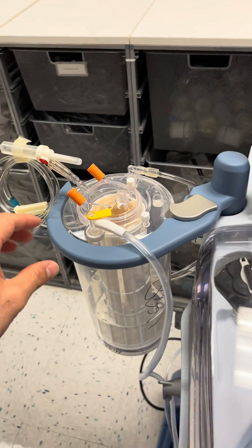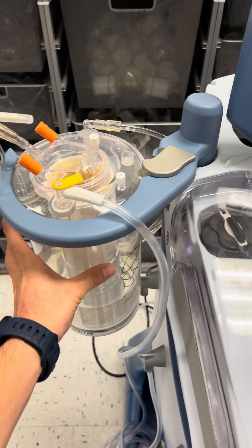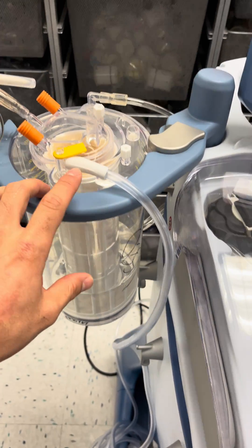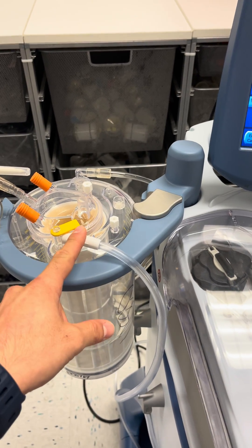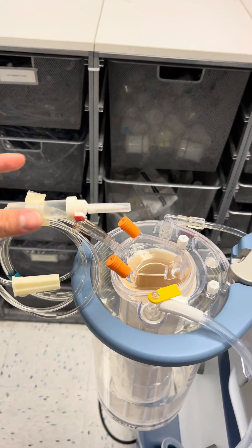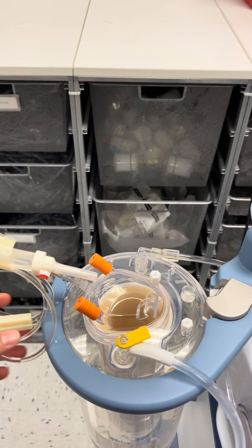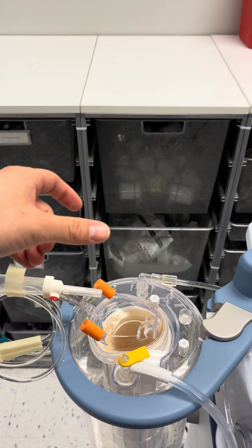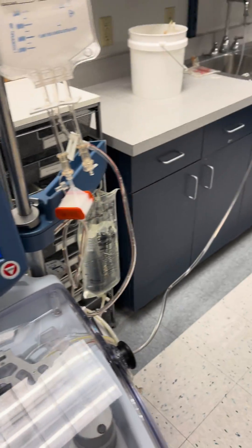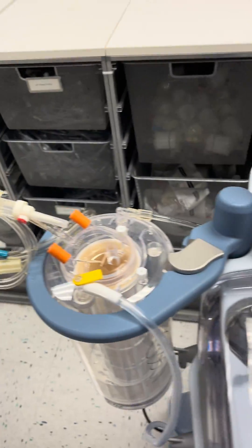We have our reservoir, and let's just assume that it contains some patient blood. Connected here is a vacuum line, which provides the suction power for the aspiration line. This is the line that gets connected to the field — they have a little suction tip they use to take blood from the field. Right now my patient is the sink, so just pretend that's a real-life patient.